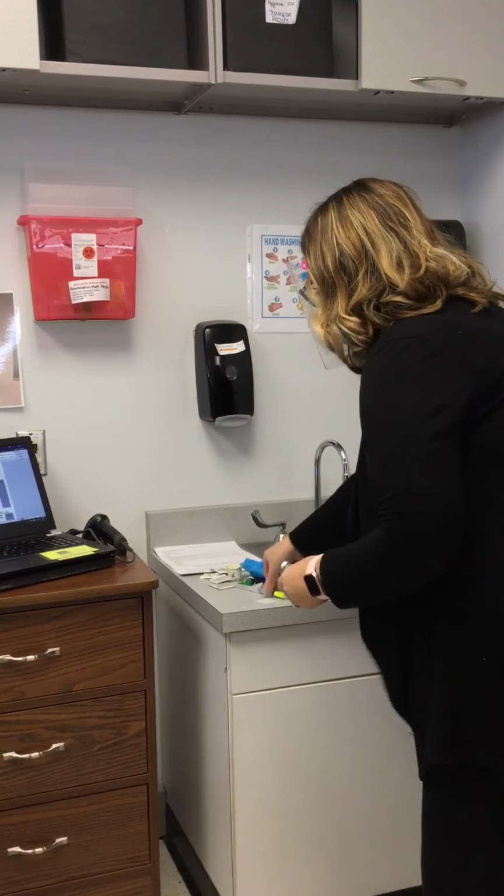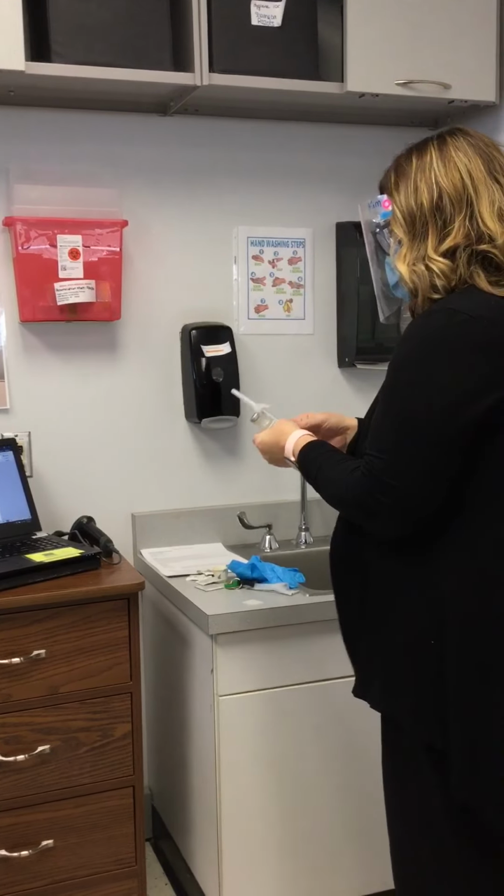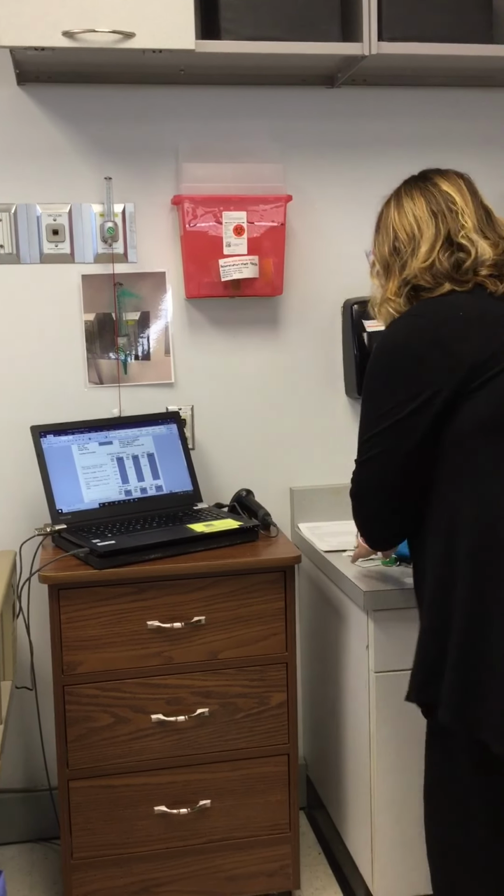Okay, so the 2 mLs that I drew up is part of the first check because I have to make sure that I have the right amount. Check the barcode, it's not expired, it's 15 milligrams per ml, and I have 2 mLs, and my order says I need 30 milligrams. So this one now can go over here. The next medication is glyburide.